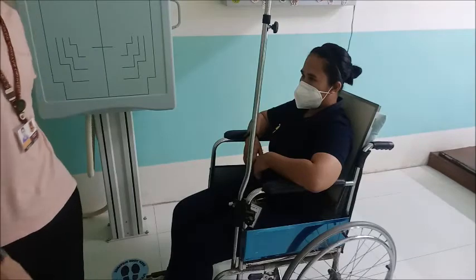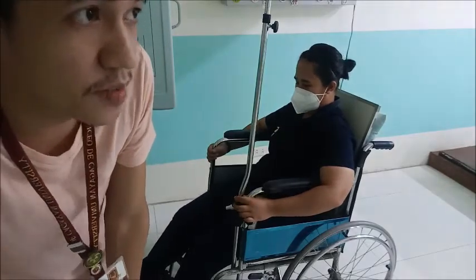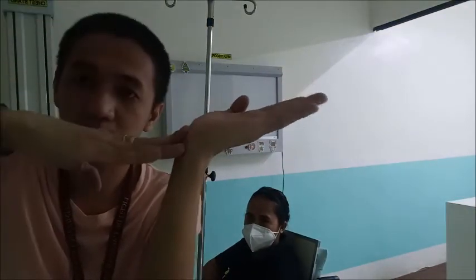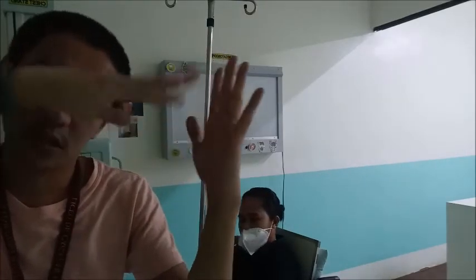If your patient is on a stretcher, as you can observe in hospitals, the head side of the stretcher can be tilted. The foot side and the head side can be tilted. So if the patient cannot stand, just tilt the head side of the bed, and insert the cassette behind the patient's back. If your cassette is tilted, make sure the X-ray tube and the cassette are always perpendicular. The X-ray beam and the cassette are always perpendicular.